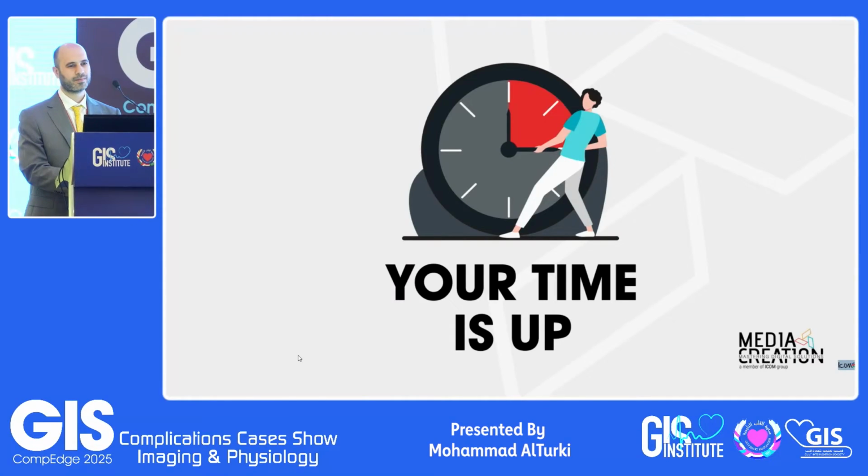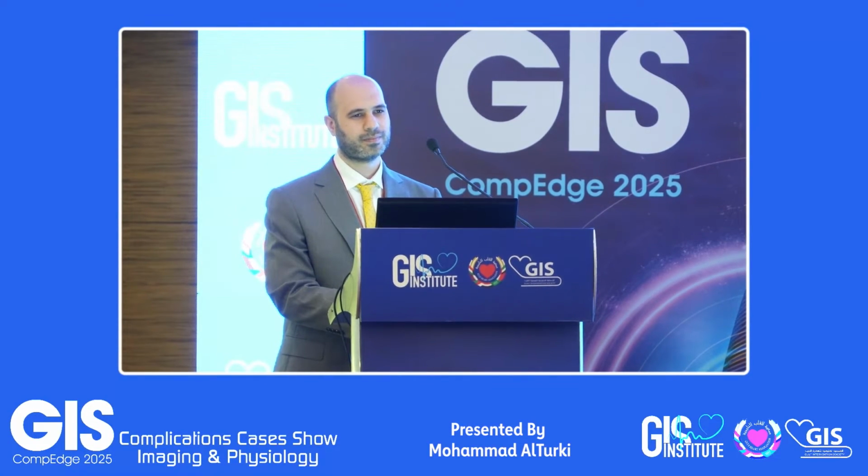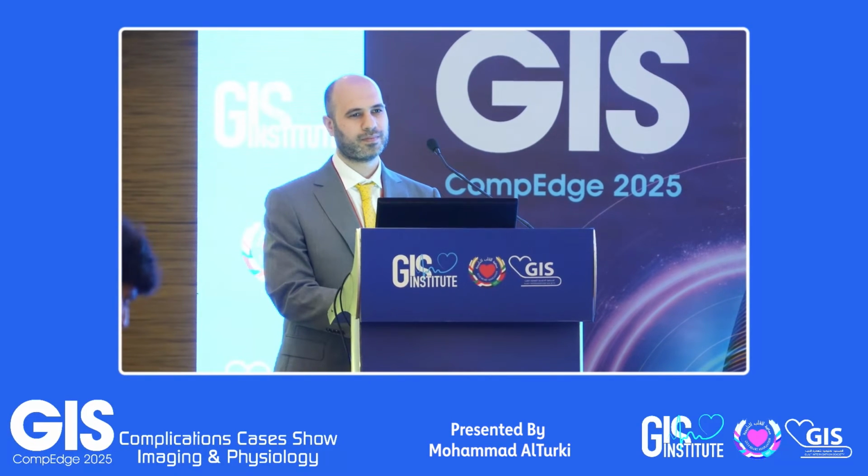I disagree with you utilizing a very stiff Gaia Third, which is a tapered tip, because you can easily perforate and be outside the vessel, and then you have a perforation of the AV circ, and you'll end up going from a disaster into a more disastrous situation. This was a matter of luck here, because if you push the Gaia Third, it's a directional wire, it could just perforate, and there's usually a bend in this area.